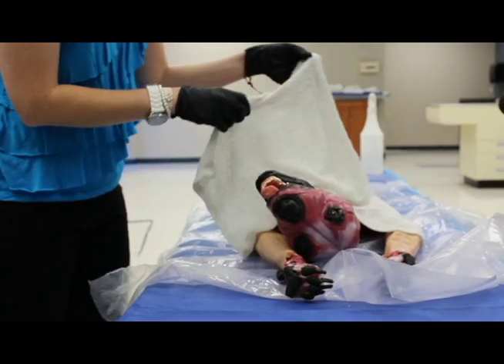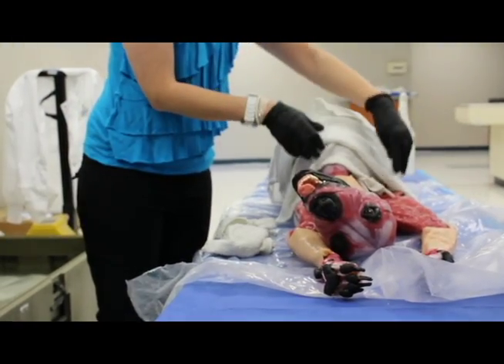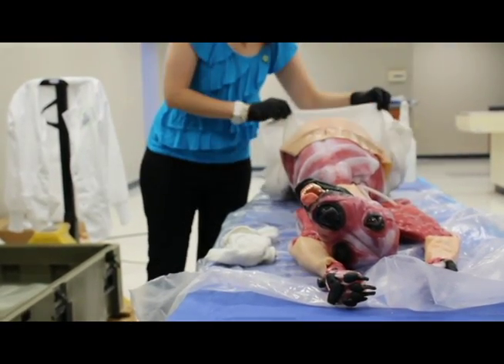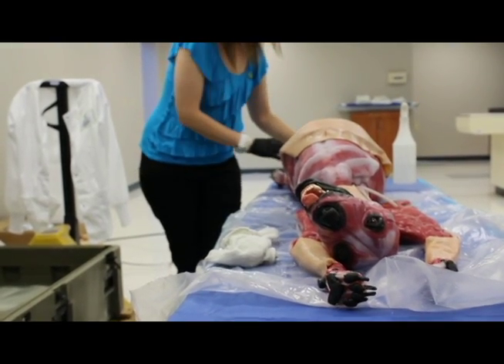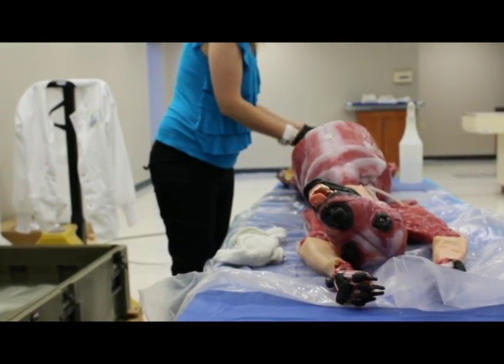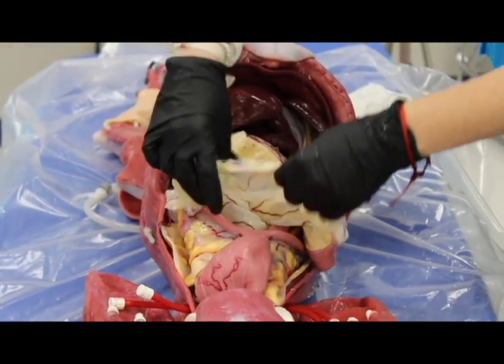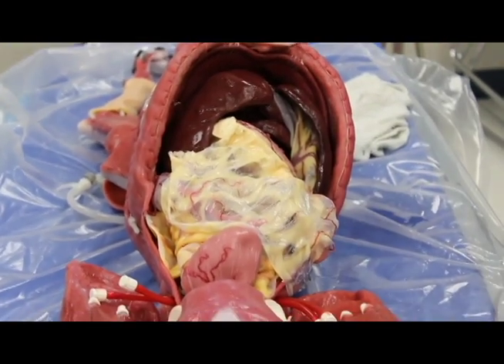So the face is the scariest part of it. Her abdominal skin comes off here, so you can see all of the fun organs inside. She is anatomically perfect — everything as you would see or expect to see in a real-life specimen.